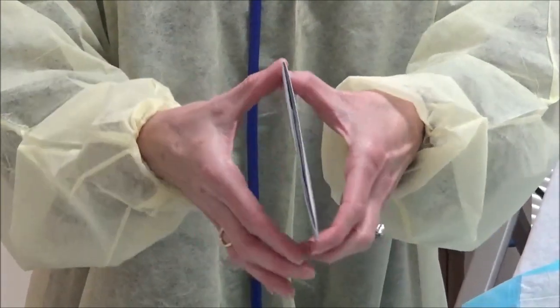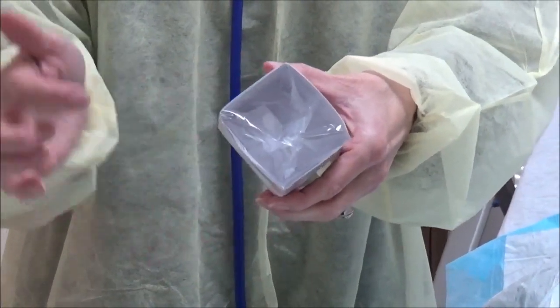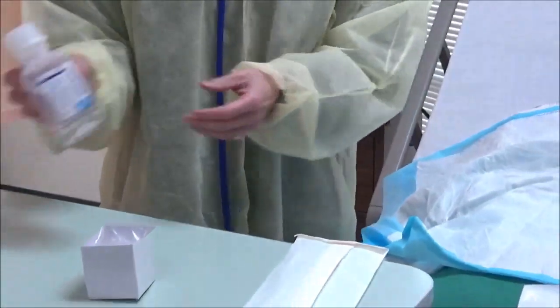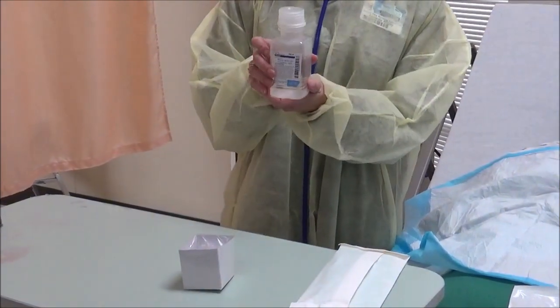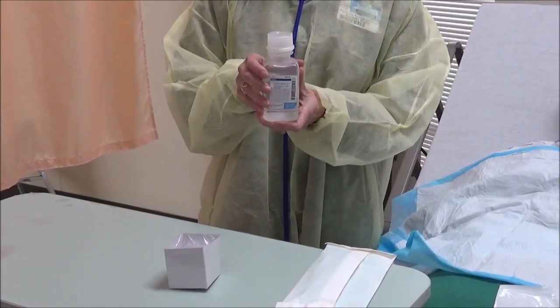That's where the water is going to go in. So I squeeze it and open that up. And again, I don't want to touch anything inside of there because that's what's sterile. I'm going to set this here. Now I'm going to open my sterile water. This has been opened before, so I want to check for clarity. I want to check the expiration date on it. And because it's been opened, I need to make sure that I lip it.